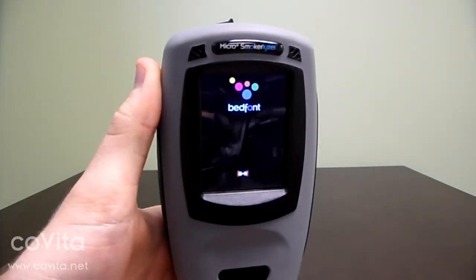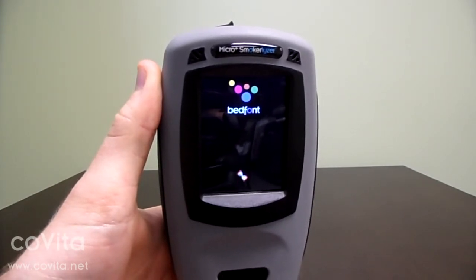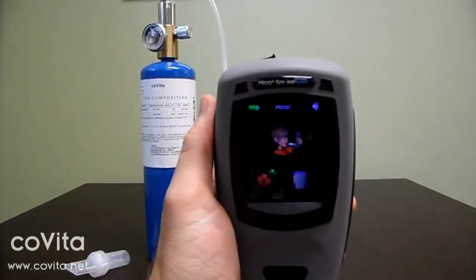You can navigate through the MicroPlus menus by either using your finger or one of the enclosed styluses for more precision. Once on the home screen, touch the gears icon.